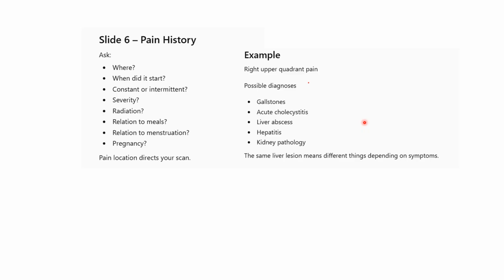The same liver lesion means different things depending on the symptoms.